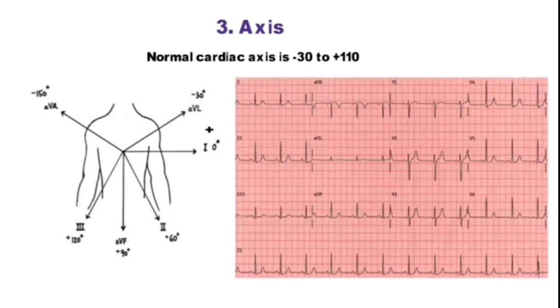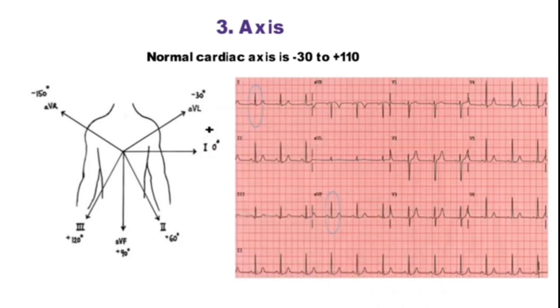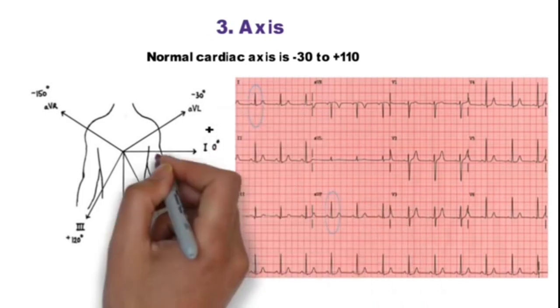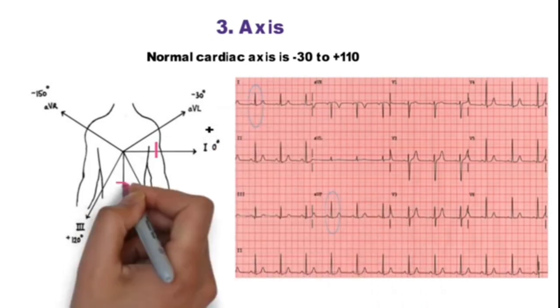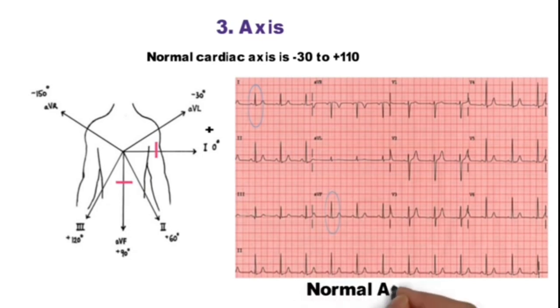In this ECG, net QRS complex in lead 1 and AVF are positive. If we plot these positive deflections on this diagram we will get a vector in the normal cardiac axis range. So this is a normal axis ECG.